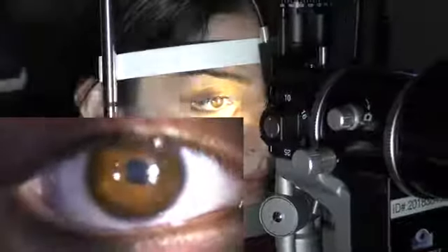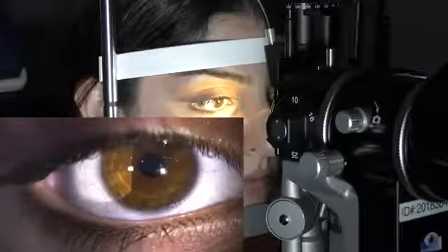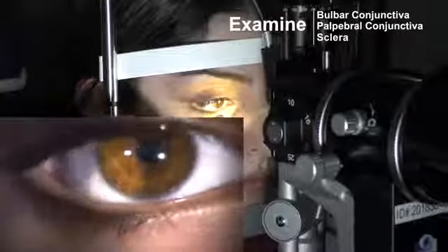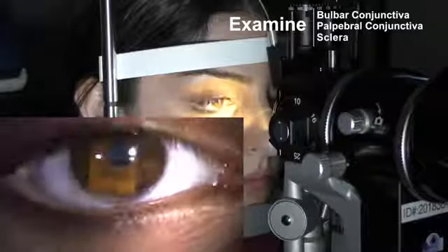So basically move across the eyelid, take a look at all the structures. Next, again, I want to be systematic, so I want to move from out to in. So I've done my lids, my lashes, my lacrimal system. Next, I'm going to move on to the sclera and the conjunctiva, okay? So I'm looking at the conjunctiva. What I like to do is have the patient actually move their eye as I focus on different areas of the conjunctiva.